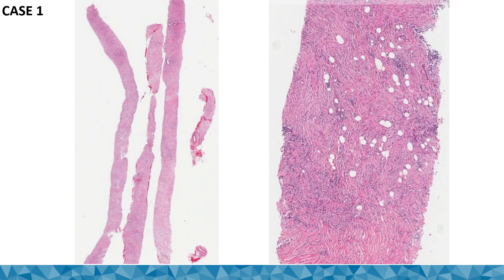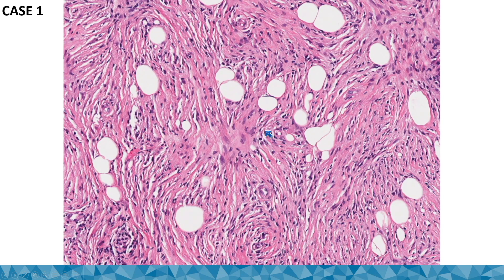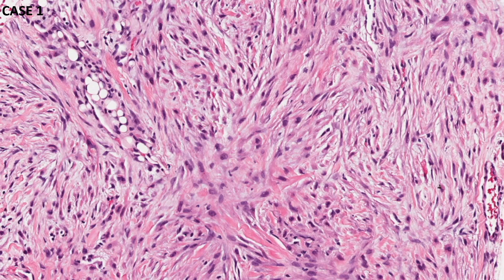There is scattered inflammation and a kind of whirling pattern. On closer magnification, you can see that the atypia is low to medium grade, with some hyperchromasia, and there's definitely an inflammatory infiltrate component to this tumor. On higher power, you can see the nuclear atypia — it wouldn't call it striking; it's more moderate to mild.